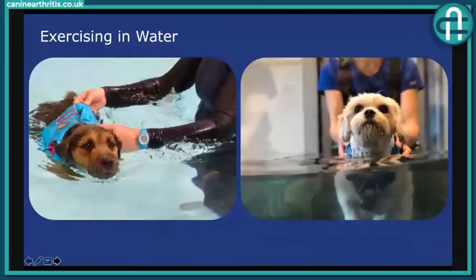In water, and for many of us that are listening, you might have heard hydrotherapy and immediately jump to the conclusion that that is swimming. It's not the case, as we will talk about. We also use water in a different way, and that's in an underwater treadmill or aquatic treadmill. There are a couple of terms that you may have heard. On the left, you'll see the dog swimming, and on the right, you see the dog in the underwater treadmill.